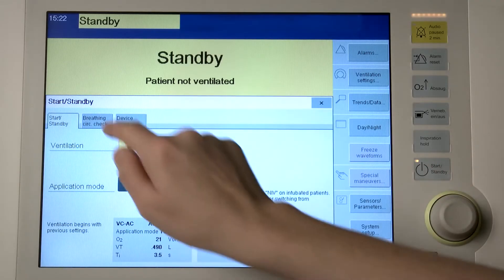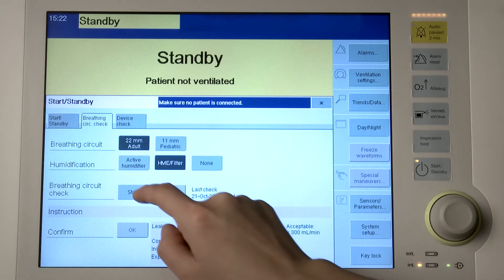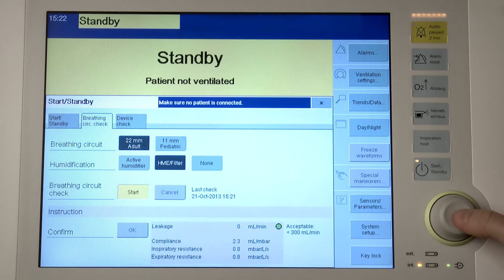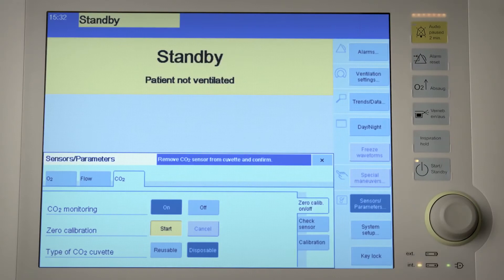Touch the breathing circuit check tab. Savina 300 displays the values of the last test. Touch the start button and confirm with the rotary knob. Now follow the instructions displayed in the instruction field.